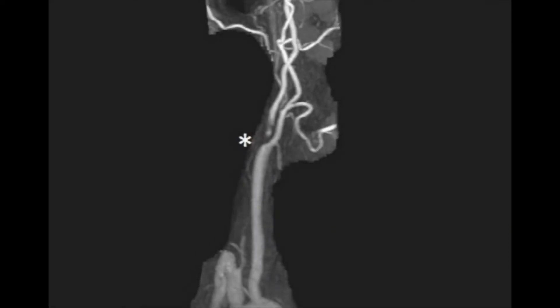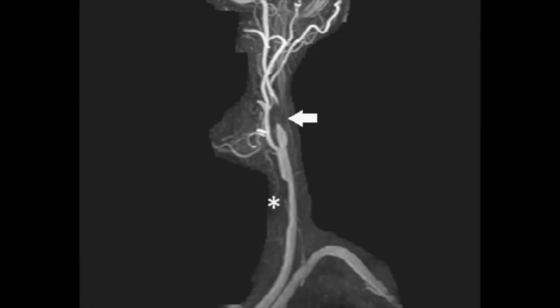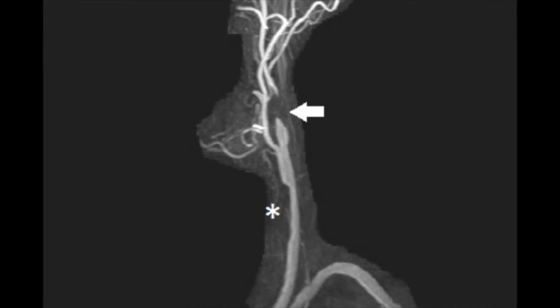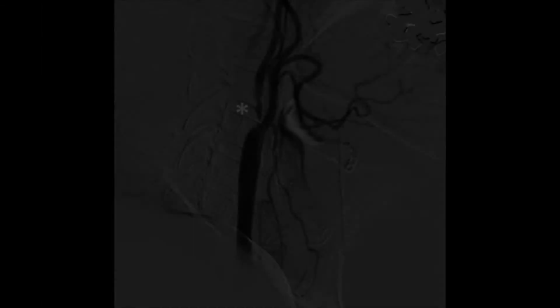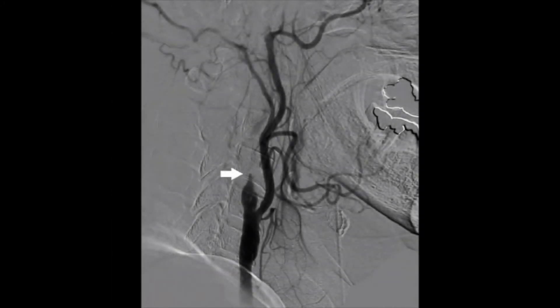3D MRA demonstrates 90% stenosis of the proximal right ICA. 3D MRA also demonstrates a common carotid artery stenosis and 99% left ICA stenosis. These findings are confirmed with injection of the right common carotid artery and left common carotid artery.